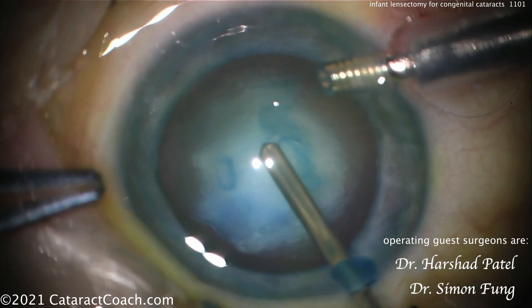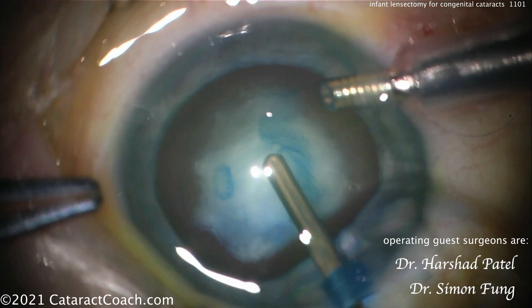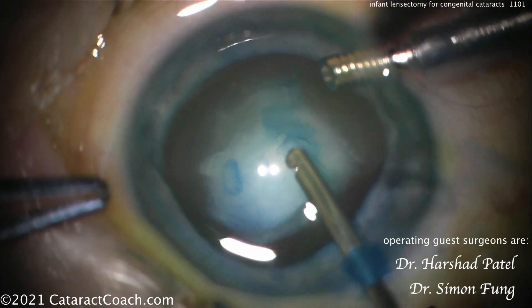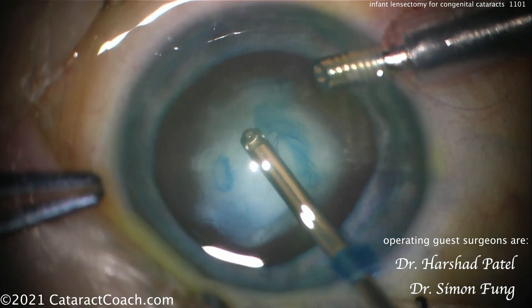There are many ways of doing this. You can do this technique, which is just using the vitrector directly. You're not going to be able to tear a capsulorhexis in a baby — the capsule is way too elastic for that. So instead you're going in with the vitrector, and this is going to make an opening or central hole there in the capsule, and then that can be enlarged.